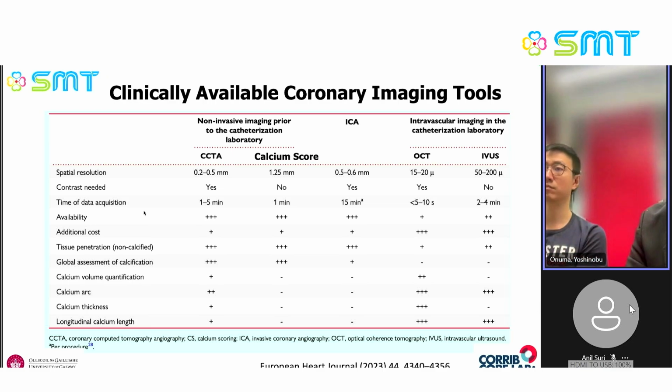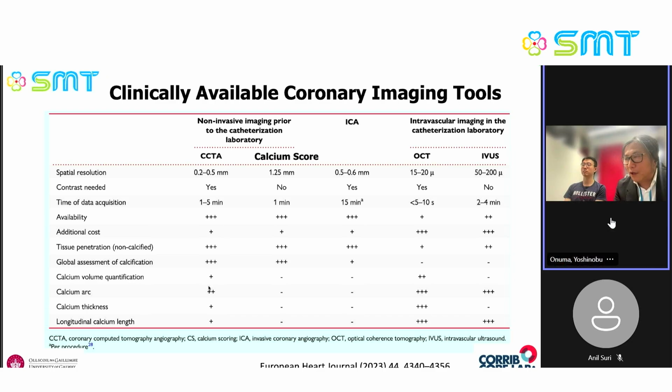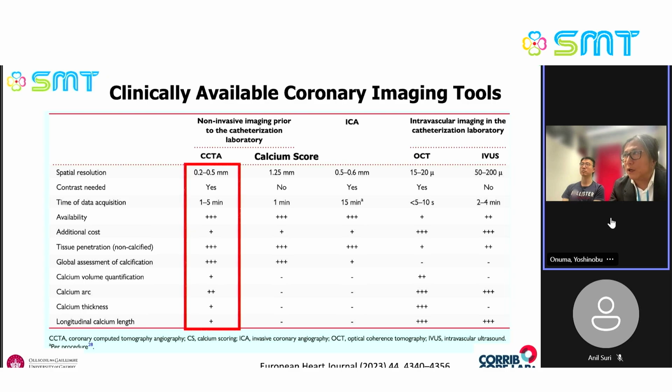This table is from the EAPCI consensus about calcium. It is focusing on calcium, but even with calcified lesions, you can use CT to plan complex PCI, such as left main and so on.